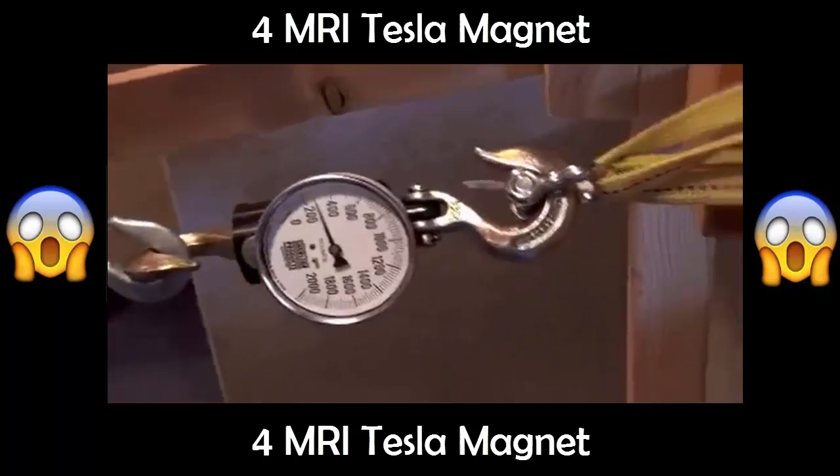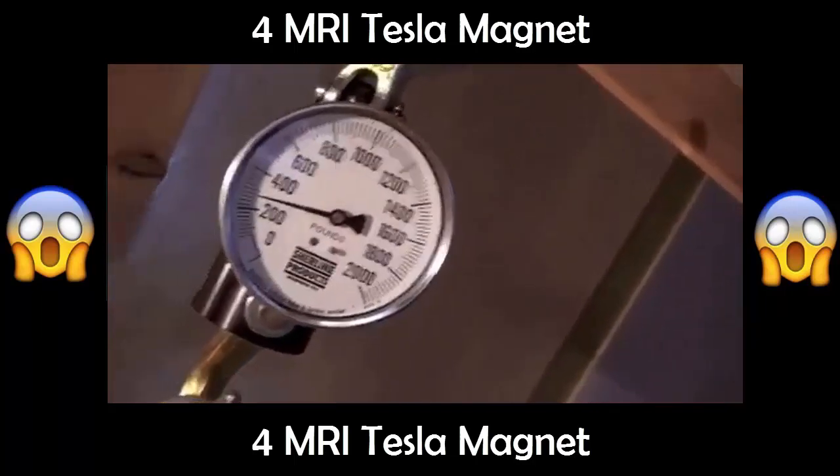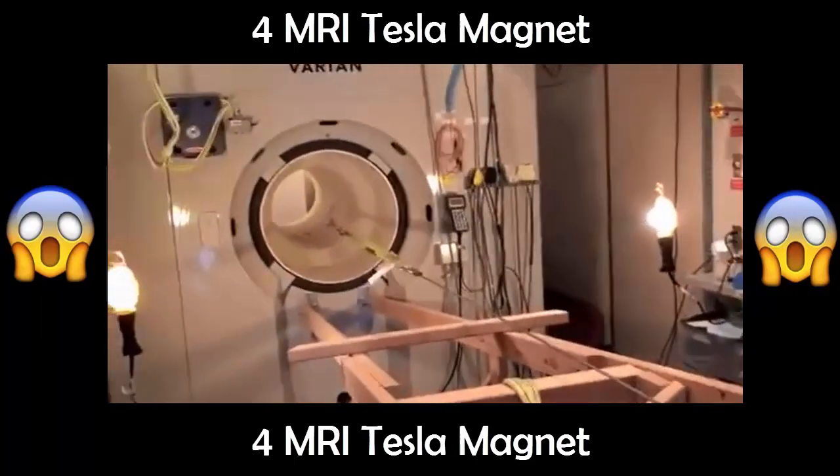So the force we're reading on that guy right now, just at that part of the magnet, is close to 300 — 280? Yep, pretty good. See what we can get.